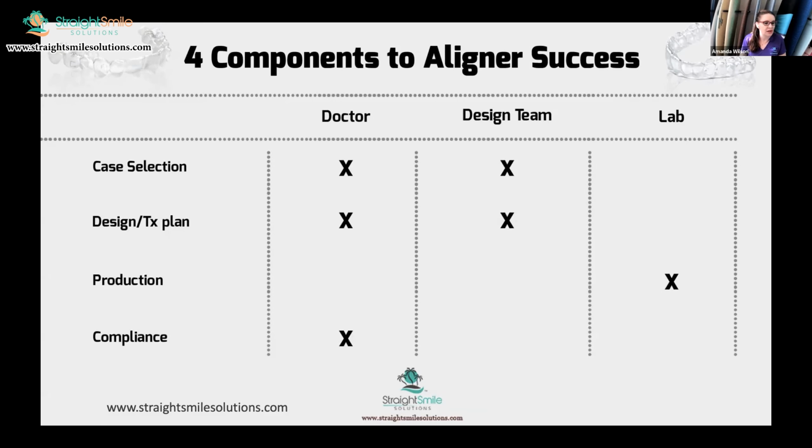The biggest mistake I see most doctors make is that the treatment plan was just not optimal. And you really can't trust your technicians. 99 times out of 100, an orthodontist will never see that treatment plan. Technicians sometimes are just trained right off the streets. They don't know anything about teeth, health, gum. Is that predictable? If it's not, it's just a video game that they're playing. And they tell you that. That's ultimately why you have to approve it.